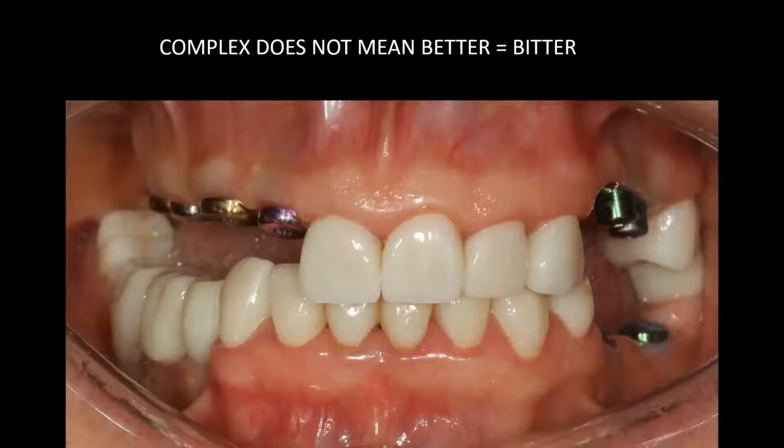This is a complex problem that I have to face. The implants were placed and the patient was sent to me, saying, look, I don't know what to do with this patient. Can you please sort this out? Now, Alex, this is a question for you. What do we do in this case? Well, if you're not sure what you're going to be doing, you definitely have to go to some sort of a provisional.